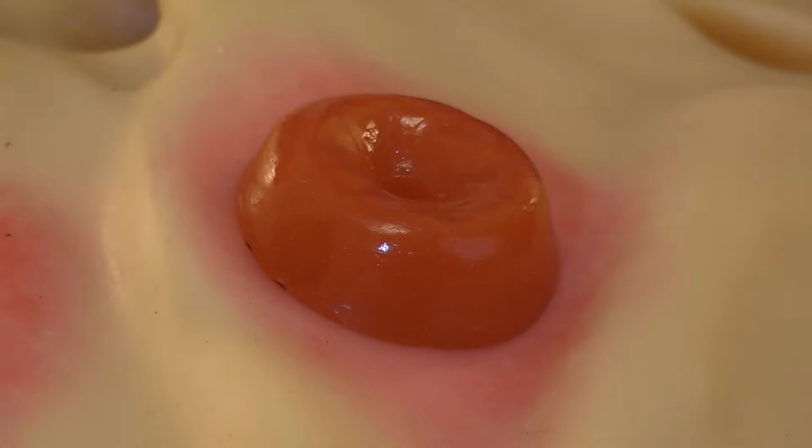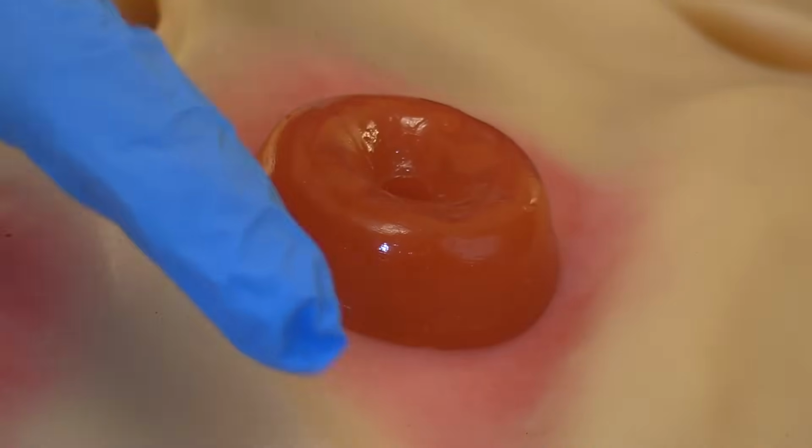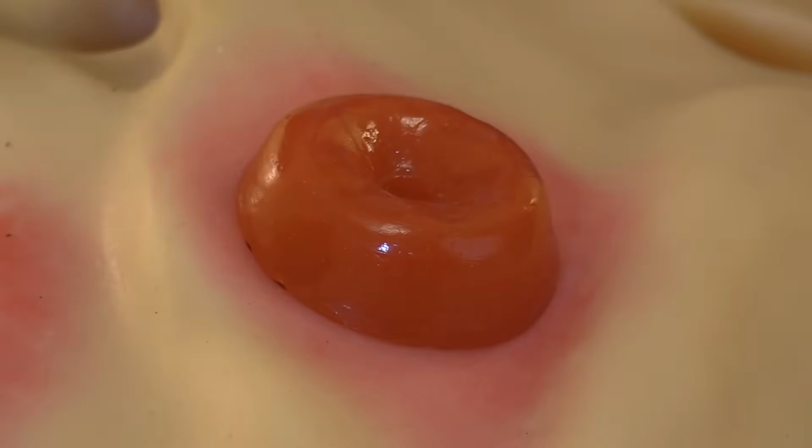Before you do it, you want to make sure you're looking around the stoma for any skin breakdown like extreme redness. Now, as you can see in this example, there is redness around the stoma. This is not good. What is happening is that stool is probably leaking under that skin barrier and getting onto the skin. So whenever you're replacing the pouching system, you may want to use a barrier ring and make sure that you're cutting the skin barrier to fit the stoma appropriately so it's not leaking onto the skin.